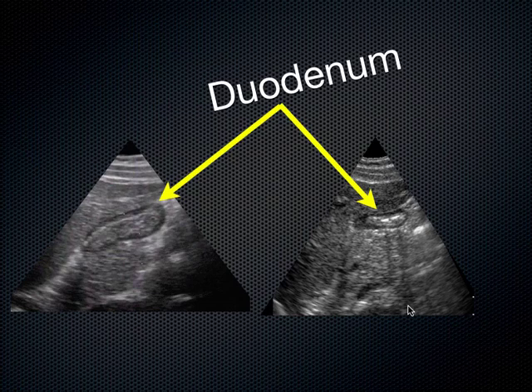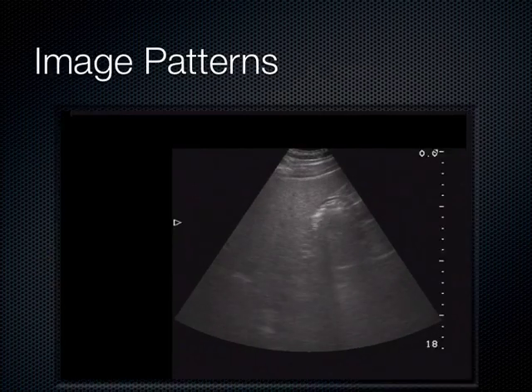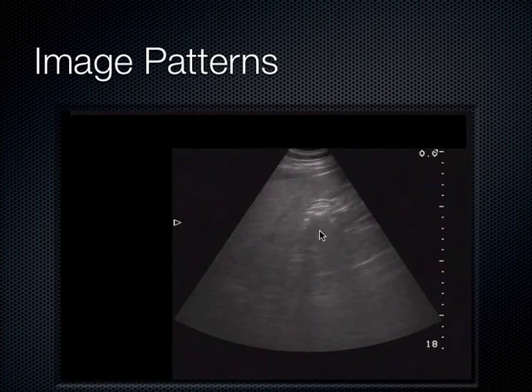See the conundrum here with the gallbladder? So I bring this up and I get very detailed with it because we see so much of this and it's such a part of what you guys will be using it for. So I want to make sure you understand it. So the question is what we're looking at here. This is all liver over here, okay? And we see this. How would you describe that?